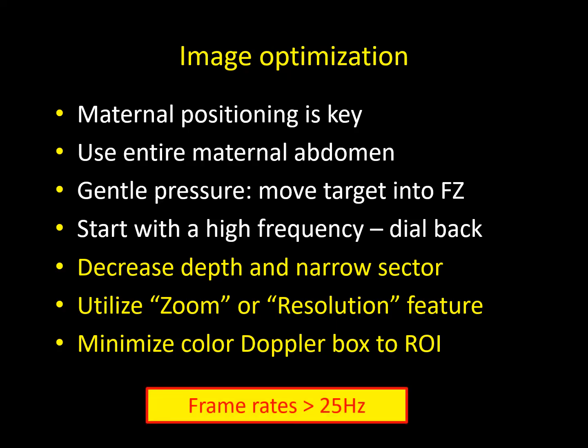And this is because all of these things in yellow raise the frame rates, and the key is to keep the frame rates above 25 Hertz as a minimum. 20 to 25 Hertz is the absolute minimum, and you want to keep it above that.